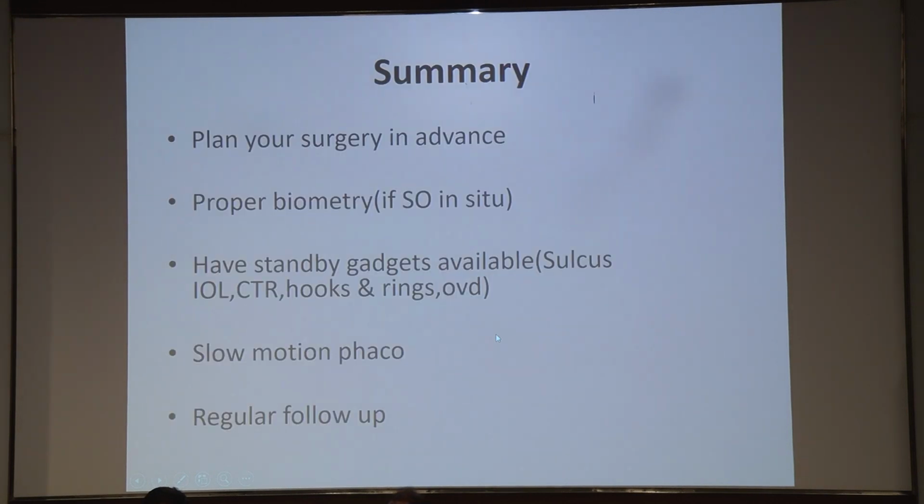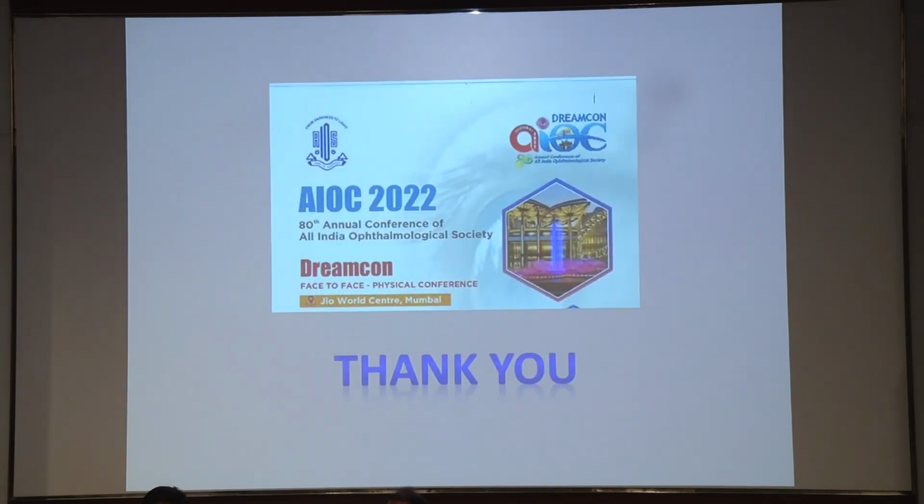So just to summarize, you have to plan these patients in advance, do proper biometry if silicone is in situ, have standby gadgets available like sulcus IOL, CTR, hooks and rings, and you do slow motion phaco to avoid any complications, and these patients need regular and long-term follow-up.